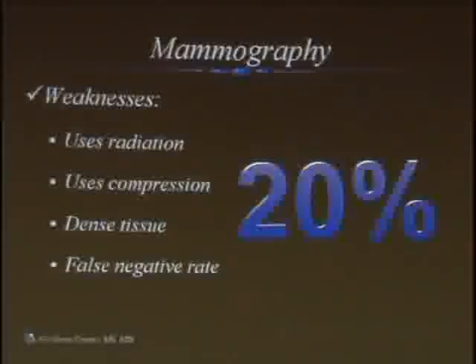That's how often we miss a cancer in mammography. That looks really bad. But we have a miss rate that high when it's a breast that is predominantly high density. And you'll see on our reports, the first sentence of a mammogram report should be the description of the density. Why? Because that sets the scene to you about how sensitive this study is going to be to the detection of a solid mass. If it's a high density breast, there's a 20% chance to miss something. If it's a low density breast, this goes way down to next to 0. Okay? It sets the scene about how accurate that mammogram is, and that's why we always say that first.